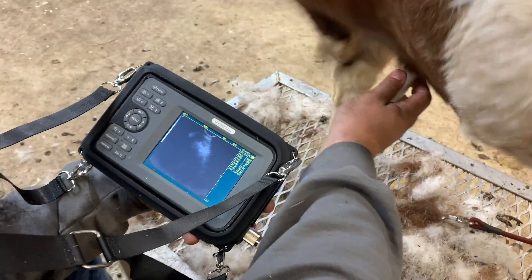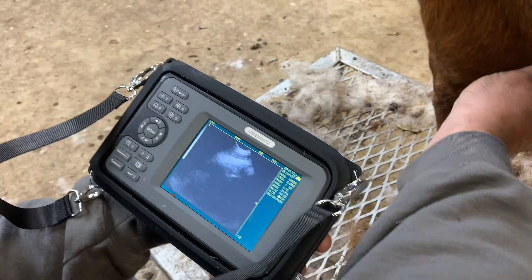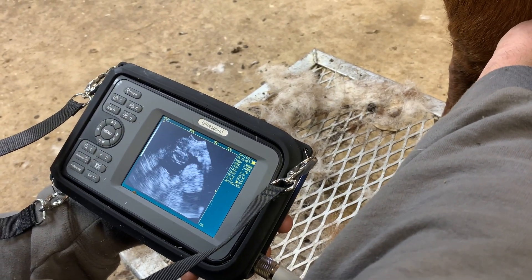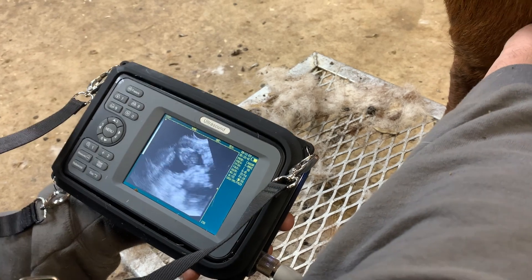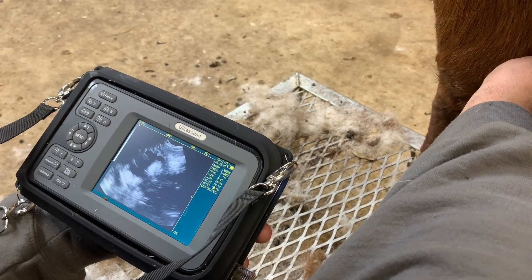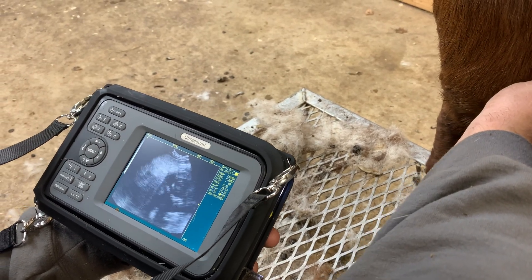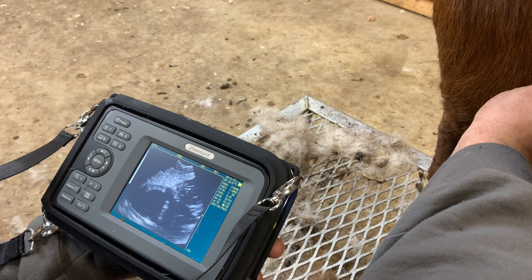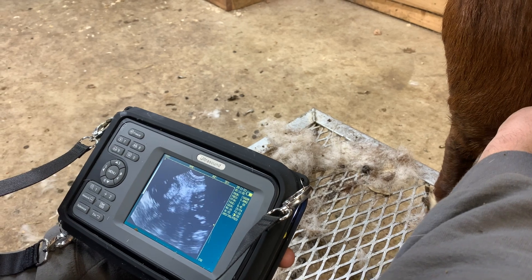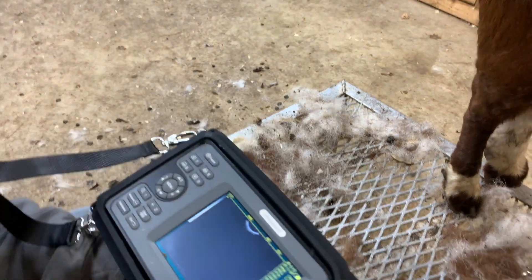Sometimes they don't like it. It's already right there anyway — right there, you see right there? See it moving? So she is bred.